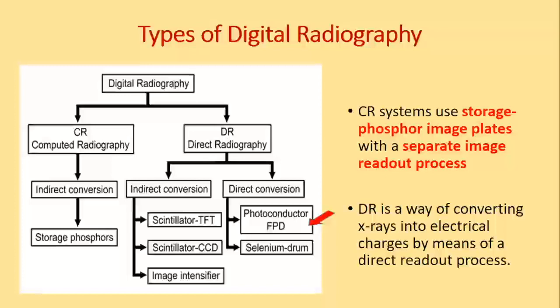In CR systems, you have a phosphor plate that looks typically like your panoramic film, the typical 5 by 12 film. You have an old 2D cassette. You place the CR phosphor plate within, close the cassette shut, and suddenly your machine is behaving like a digital radiography unit.